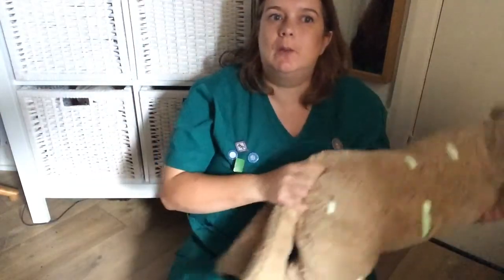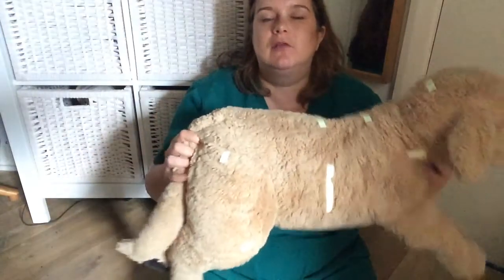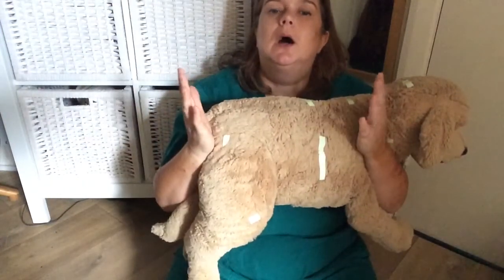Hi, it's Jane RVN, and we're here for another little imaging session with our little Swedish friend, who is rapidly becoming a little glow-in-the-dark special friend. This time we're going to have a look at doing our lumbar spine.